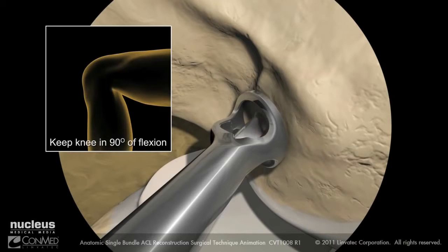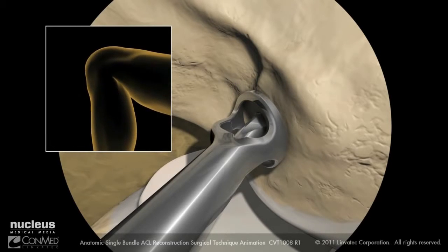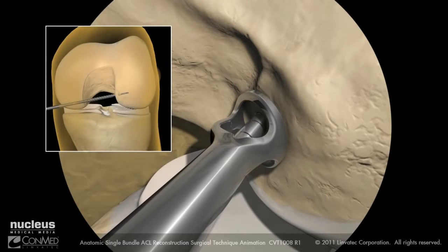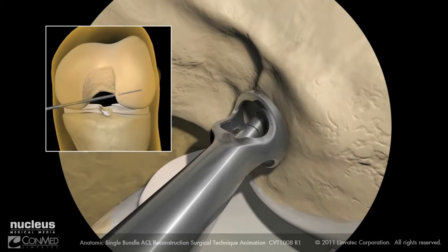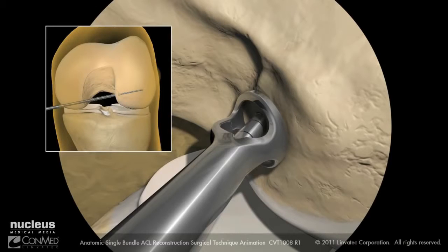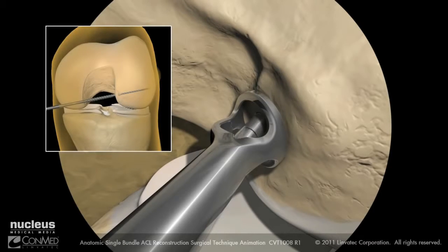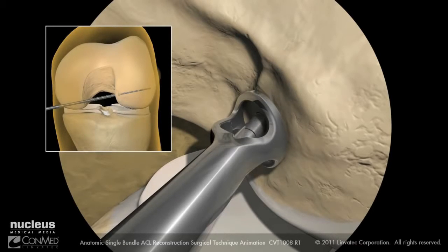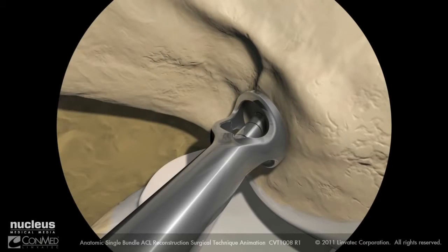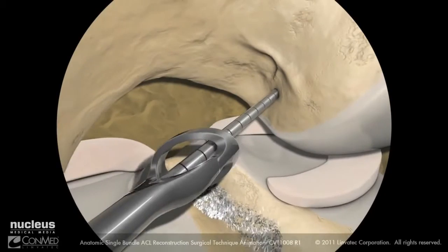Using the guide to position the guide pin, hyperflex and elevate the knee. Advance the guide pin to the lateral femoral cortex, noting the aperture to cortex depth, then advance out of the skin. Continue advancing the guide pin out through the skin laterally, using a twisting motion to remove the femoral footprint guide.